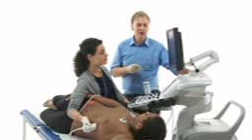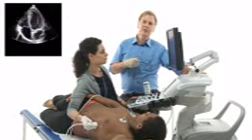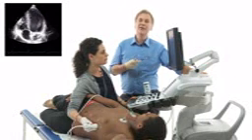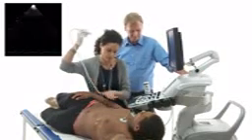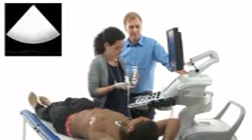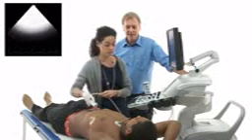Now, we would like to also show you an additional view that I would recommend, especially if you don't have good image quality from an apical position, which is the subcostal view. Exactly. It gives you a lot. Please turn on your back and relax muscles. So you've seen the subcostal view on several occasions.